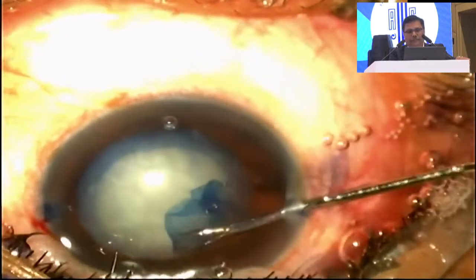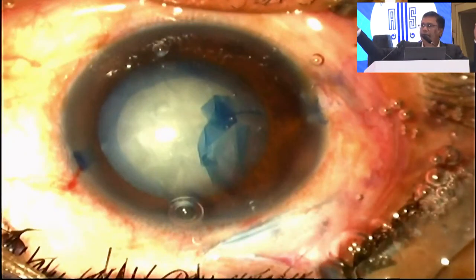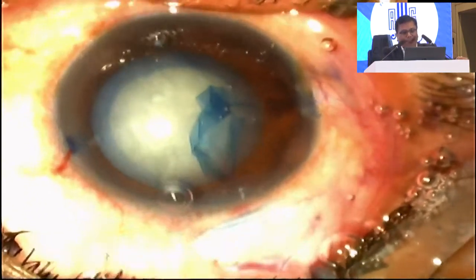See, that's the sub-incisional running away is very common. What we have to keep in mind is that the formation of the anterior chamber is really good throughout the procedure. If it is getting shallow, you should not be overconfident that, okay, I will manage, because all the time we are in a hurry. And this is the typical point where the surgeon's mind plays and the capsulorhexis runs away.